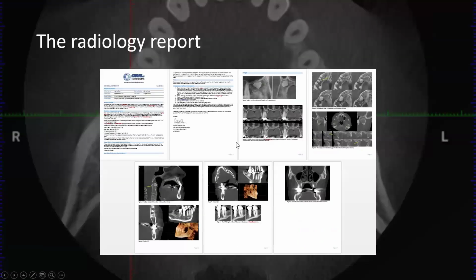But there is a lot of stuff you can look at and a lot of stuff that can benefit the patient. So there were all these periapical lesions that weren't being addressed. I just happened to review 60 patients because they had repeat imaging. If it was within 6 months, I tell them not to send it to me again; I'll just review and compare and see if there's anything new. And in these 60 patients, 12 of them had undiscovered periapical pathology, a surprisingly high number. As I went back and reviewed them, in a lot of cases it was 6 months or almost a year later, and nobody had looked at my report or done anything about it.